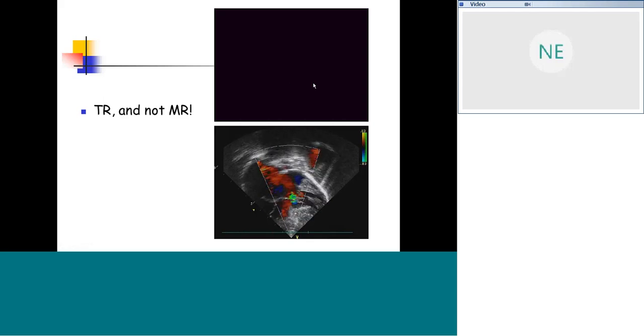The left-sided ventricle is more coarser, the right-sided is more smoother. This is L-looped ventricles, and hence here this is tricuspid regurgitation and not mitral regurgitation. So it's important to form the final understanding as TR and not MR just because it's a left-sided AV valve regurgitating.